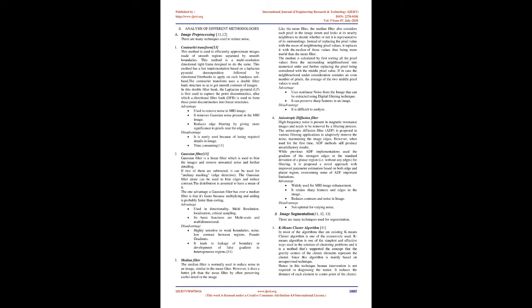Advantage. Used in directionality, multi-resolution, localization, critical sampling. Its basic functions are multi-scale and multidimensional. Disadvantage. Highly sensitive to weak boundaries, noise, low contrast between regions, pseudo-gradients. It leads to leakage of boundary or development of false gradient in heterogeneous regions.